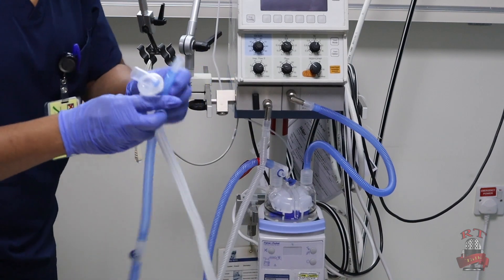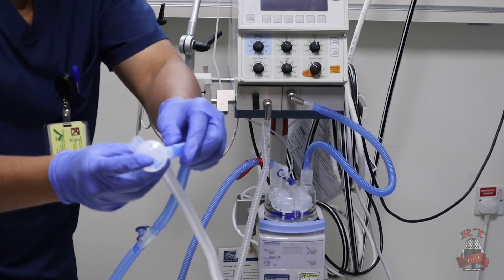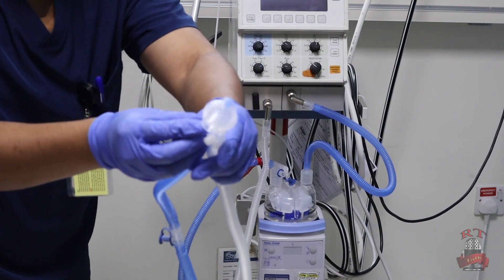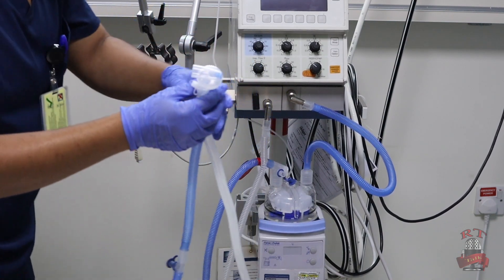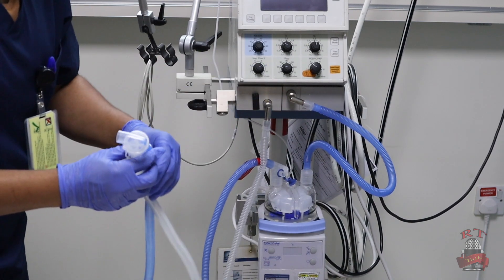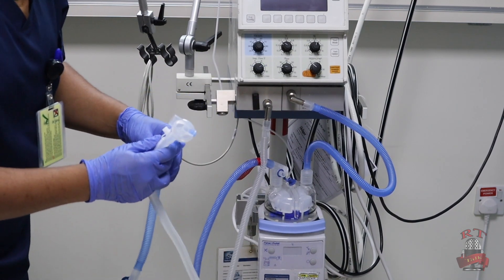After we connect everything, we will connect the last piece — our adapter for the ETT, as you see right now. Now after connecting our circuit, we will start connecting our cables for our humidifier.